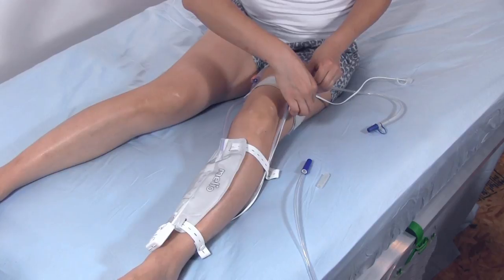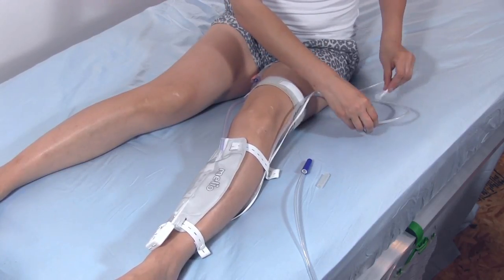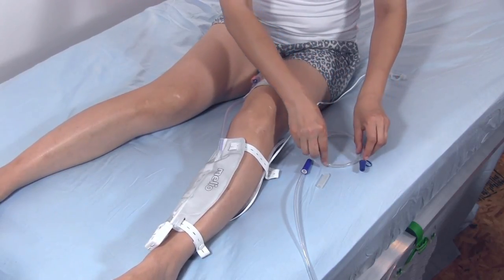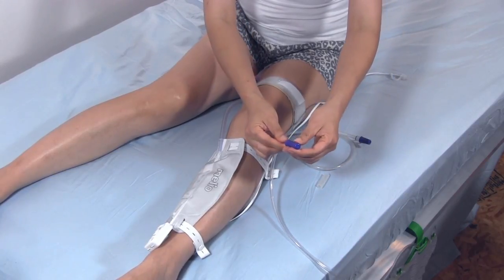Open the thigh strap and release the discharge tube and the controller cable. You may continue to use the thigh strap to secure the inlet tube as you wish. Remove the thigh strap only if you have another method to secure the catheter while you're sleeping.